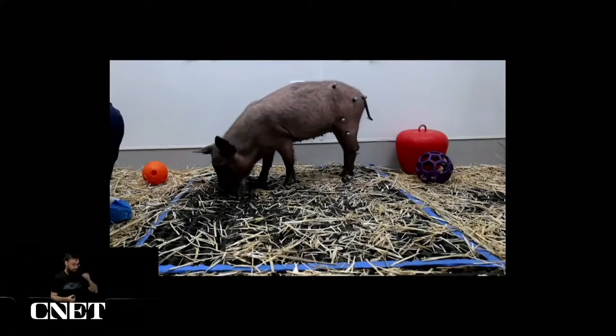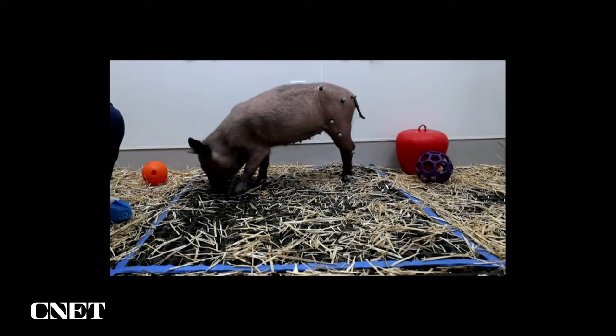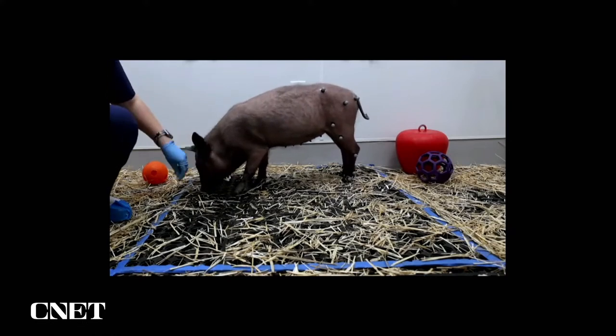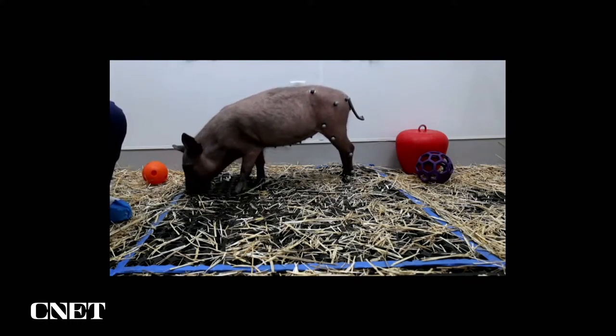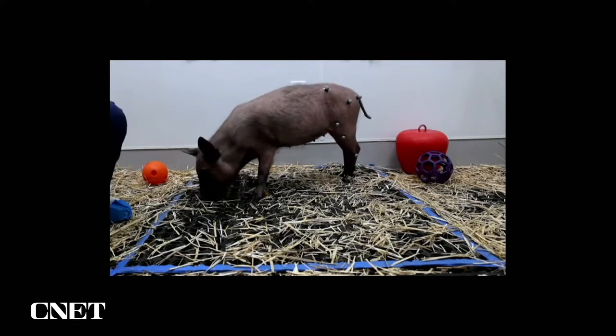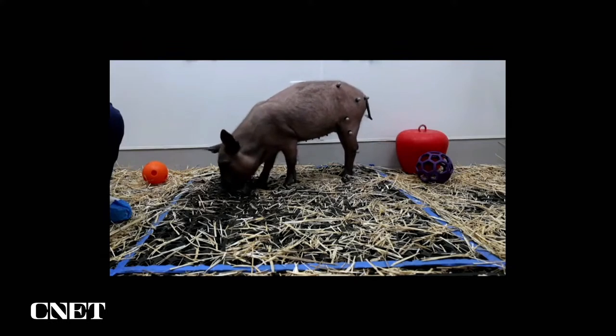Okay, so let's do that. So here's a pig, a happy and healthy pig doing what pigs like to do, which is root around for food and snacks. And as you'll see on the floor, there's a blue square. This is a voluntary engagement zone where the pig places itself, indicating that it's comfortable to receive stimulation. When it's in this zone, we stimulate, and if the pig leaves this zone, we'll stop stimulating.